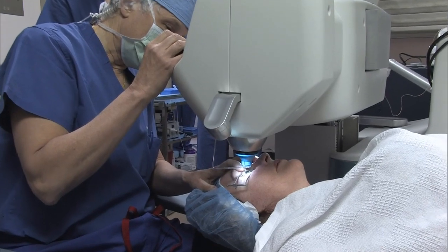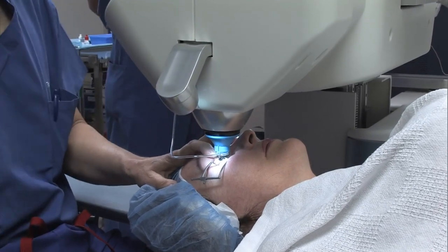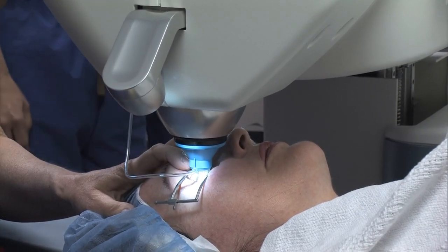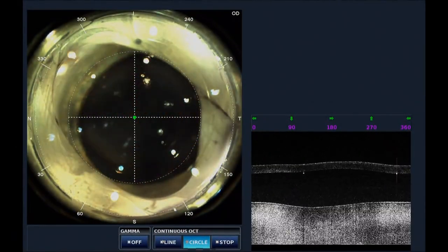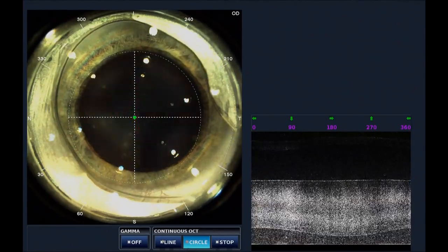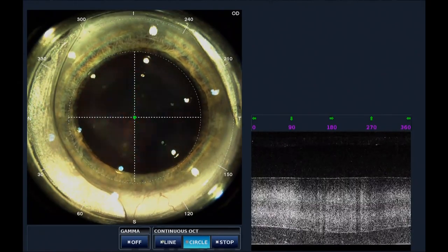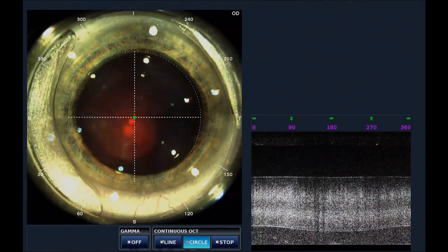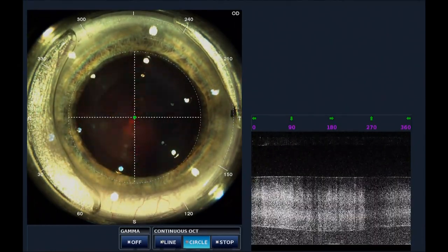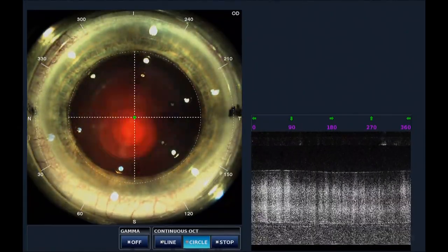So we've got Renee here, and we're going to do our docking procedure. Renee, you see that red light up again there, dear? Yes, I do. Your job, once again, is just to look straight ahead at that red light. We come down until we get a pressure of green, and let's go ahead with that, Melvin. We're past green — that's okay. I get suctioned there. And that's the docking.